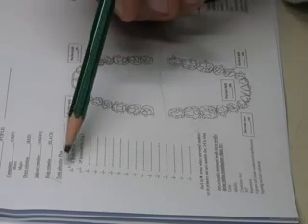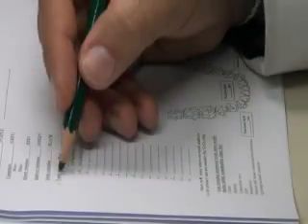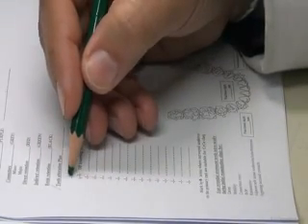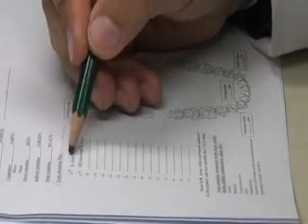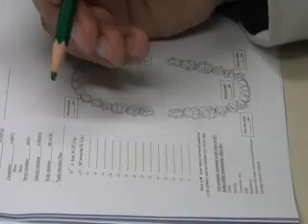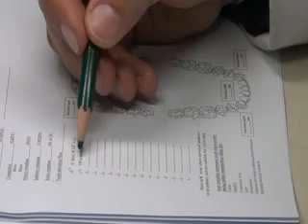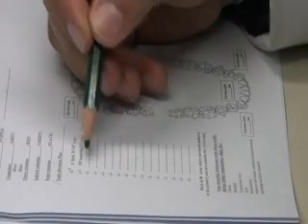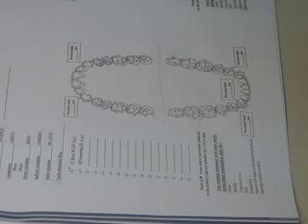For example, this is a case, distal rest, upper 6, upper right 6. Of course, this is designed in a way to have a cross. This is the cross in the middle, okay? So upper 6, we have a distal rest, and we have to prepare for a mesial guide plane. Some teeth you need lowering of, for example, distopalatally, you need to lower the survey line, for example, okay? So these are types of preparation and how you write them.